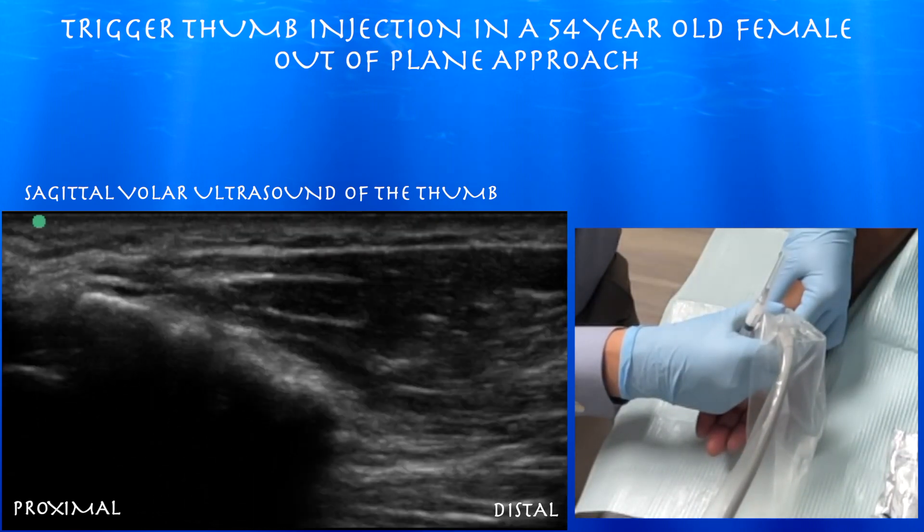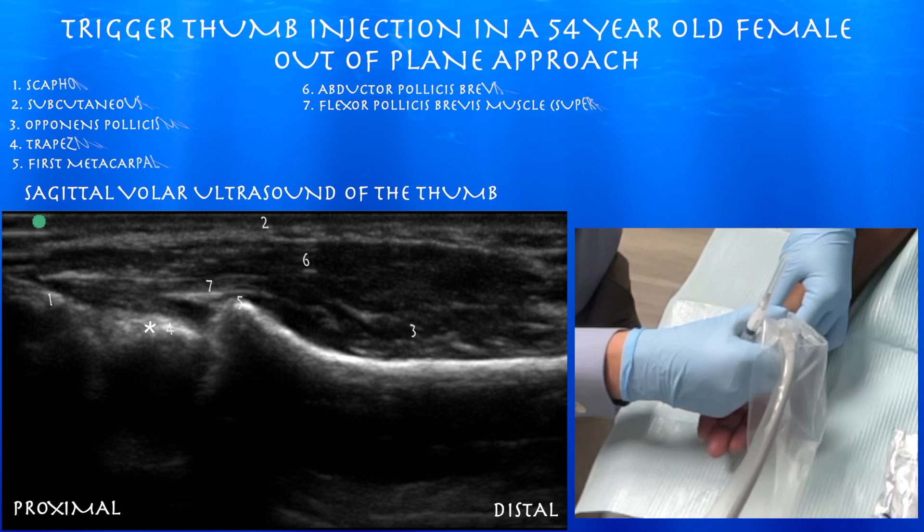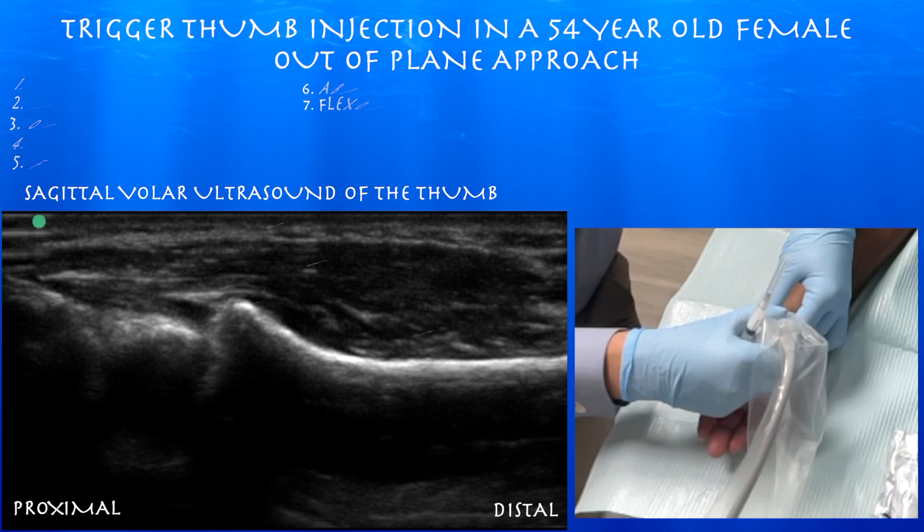Here we're going back to the CMC joint. You can see the base of the first metacarpal articulating with the trapezium, and that articulates with the scaphoid. You can also see the opponens pollicis muscle along the shaft of the metacarpal.